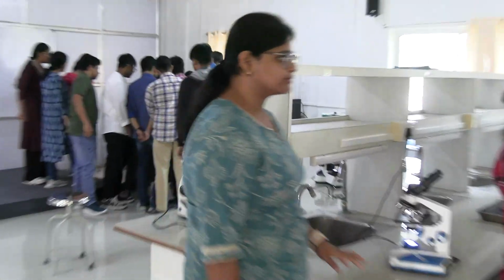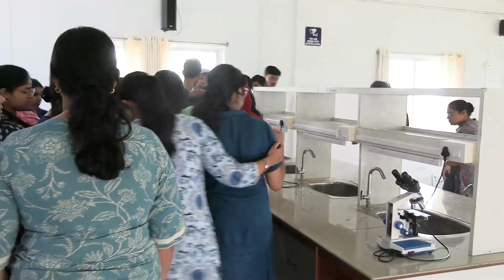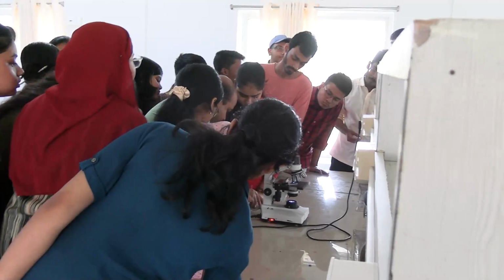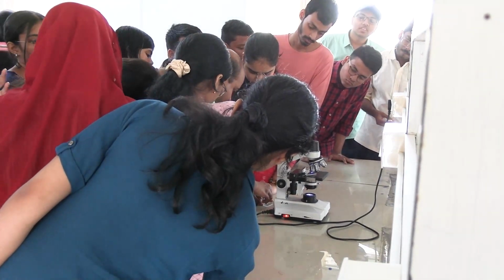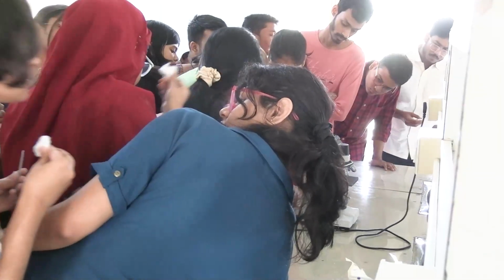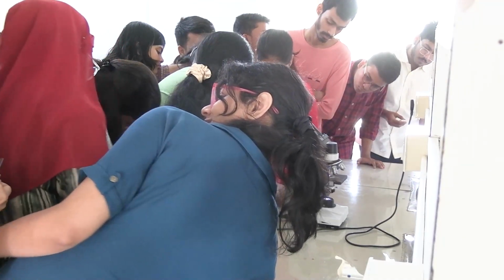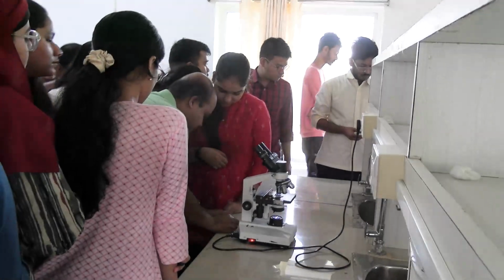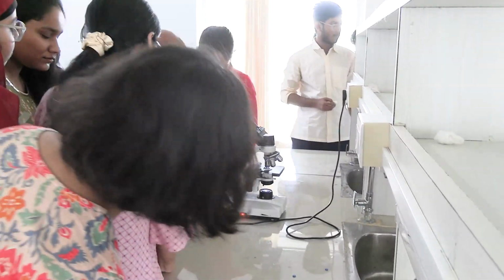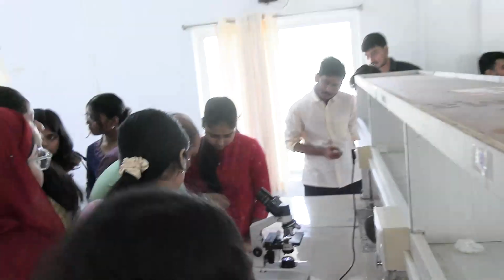You have to put the blood drop on one side of the slide. From the finger, one or two drops of blood are to be transferred over here, not in the middle. Then put the other slide in front of the blood drop, not exactly on it, because putting it directly on it may make the smear irregular. So just put it in front. Now gently draw it behind. If here is the blood drop, the blood smear will be like this, and after this it will lessen, and the smear looks like a tongue. So it is called a tongue shaped smear. This is the way.